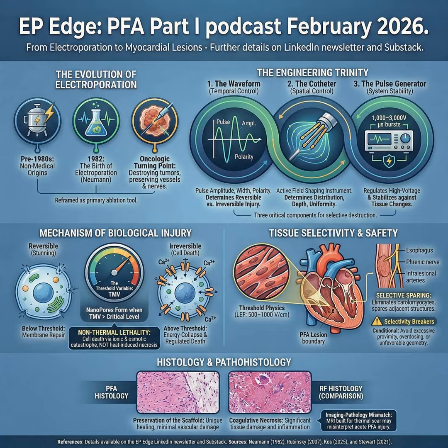History, Engineering Trinity, membrane-first biology, conditional selectivity, and distinct lesion pathology. In part 2, we'll take these principles and apply them to the clinical trials. We'll ask, how did they define success? How did they monitor recurrence? And what does durability mean when stunning and irreversible injury can coexist? And in part 3, we'll do complications, mechanisms, signals, and what to watch as adoption scales.